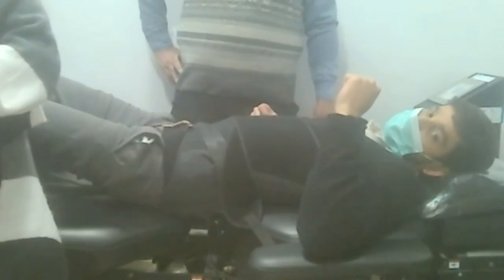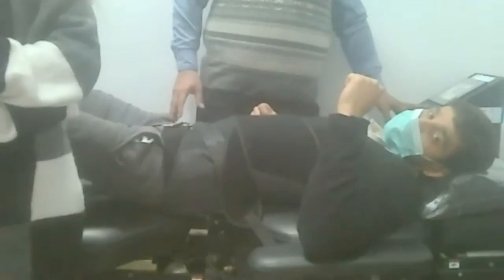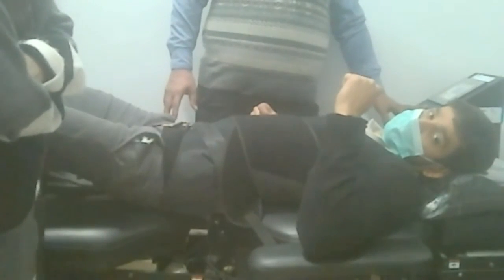Okay, so did it go down to its 11? Yeah. Okay. All right, so now it's going to warm down over 5 minutes. So again, that first treatment is going to be very gentle, and we just don't want to make the patient worse, okay? So the first visit is just to kind of see how they do.